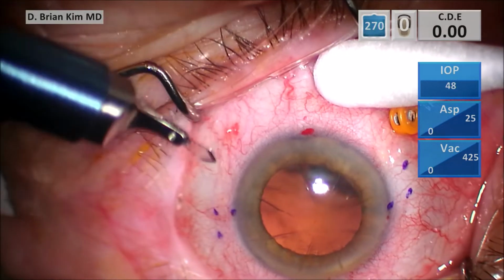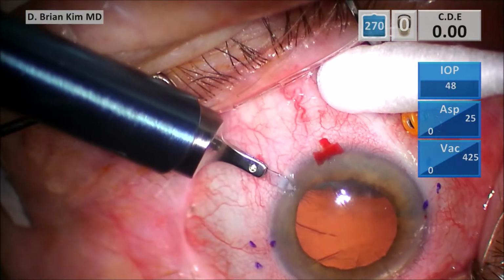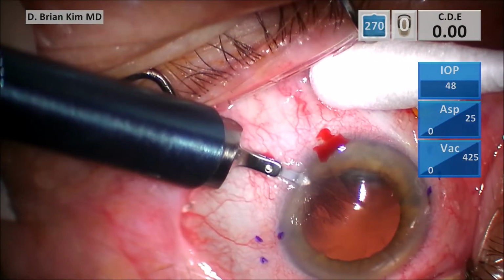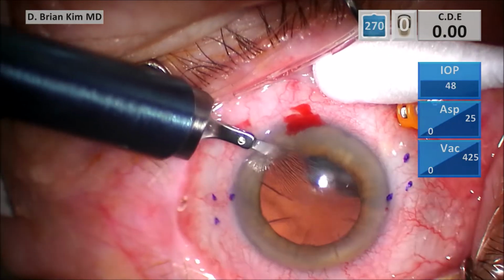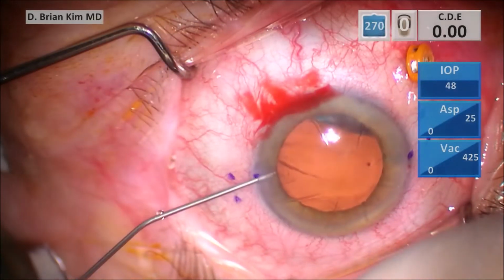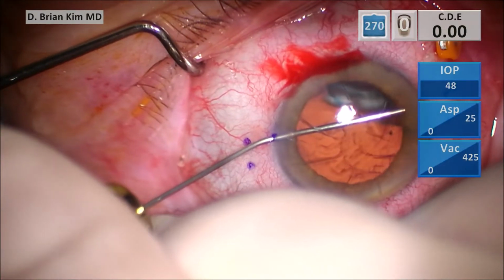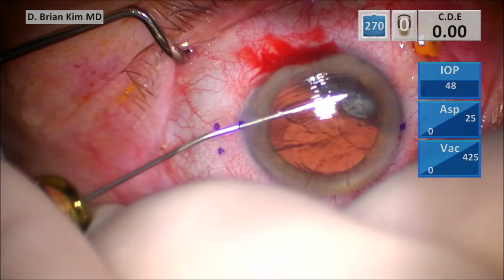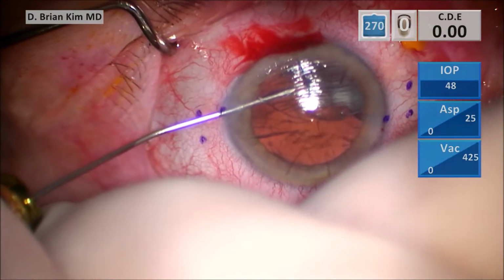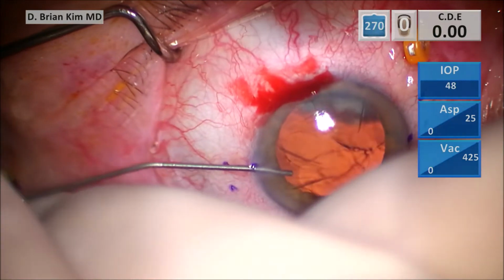So again, my 2 incisions to be able to remove the dislocated lens, the contra-incisional incision to externalize a leading haptic, and this is the last incision for my AC maintainer. I'm going to go ahead and inject some dispersive viscoelastic to coat the corneal endothelium the best that I can. Again, this patient's had vitrectomy before, so it's going to be hard to get a nice coating of the cornea, but I'm going to try anyways.